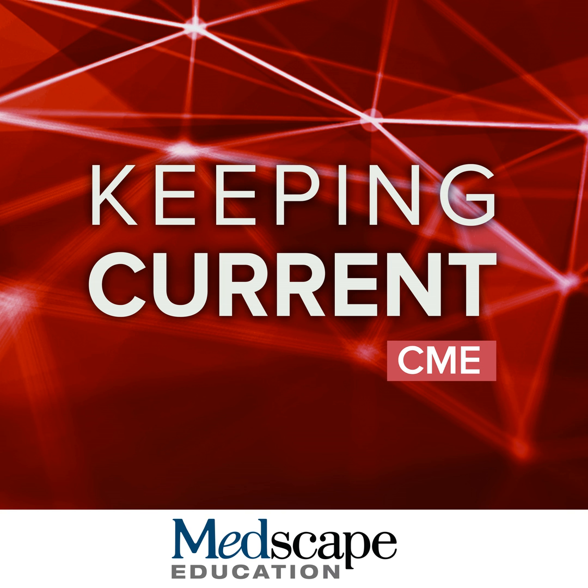And this is an example of thrombus, and it's clear that this is lying against the wall as opposed to lying within the wall. Another alteration to your technique that you can do to try and prove that it is thrombus is you can perform so-called long TI imaging. And long TI will cause the thrombus, so the blood in the thrombus, to be suppressed because of the contrast differences between blood and myocardium. And this is a technique that can be added on if you're trying to prove that this is thrombus. So a chronic infarct complicated by mural thrombus at the apex.